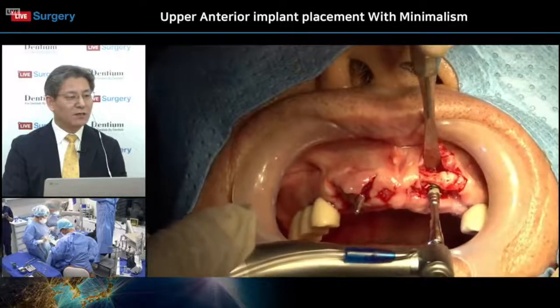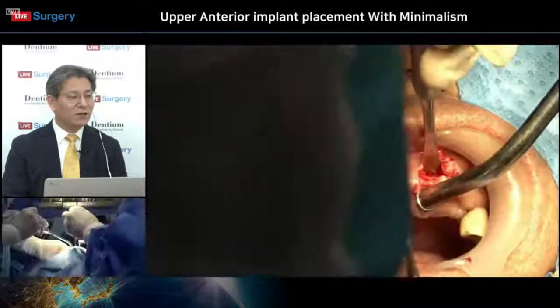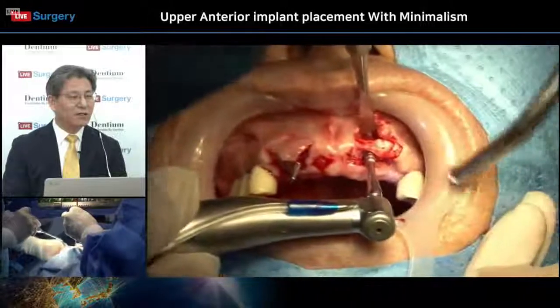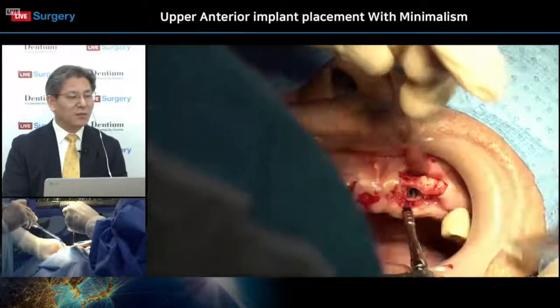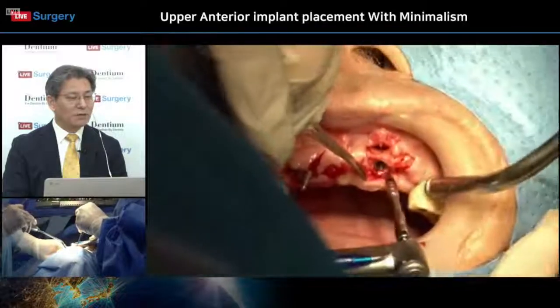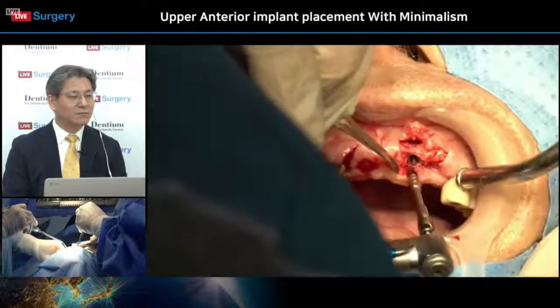A very popular concept is conserving the vertical bone height when you have an implant installation. So horizontally, 2 millimeters of bone volume is a necessary part. There is a very small gap. Yeah. But it would be fine with a small bone grafting.